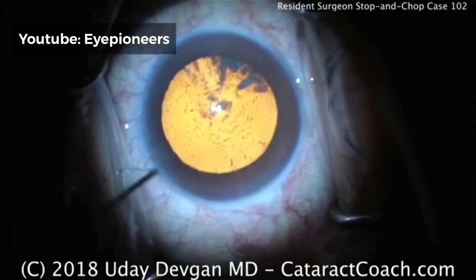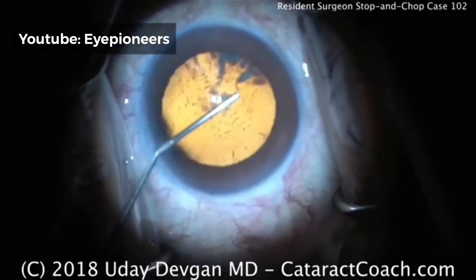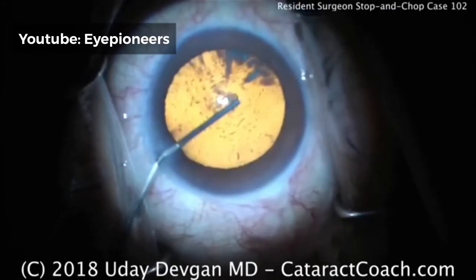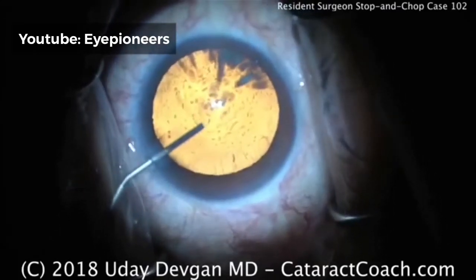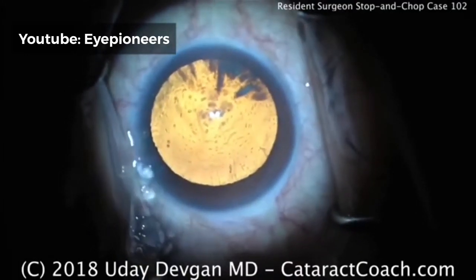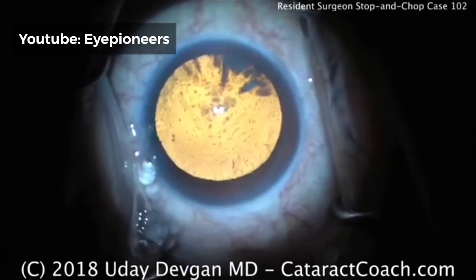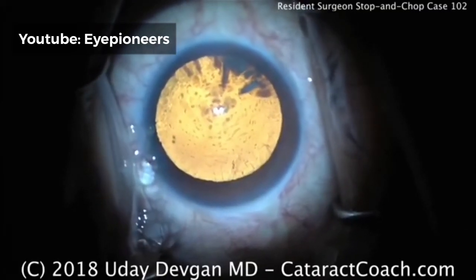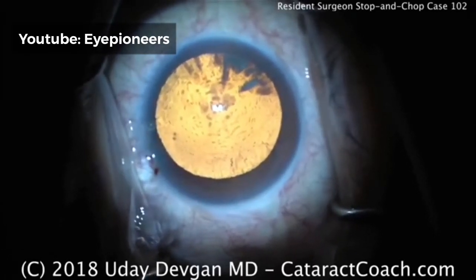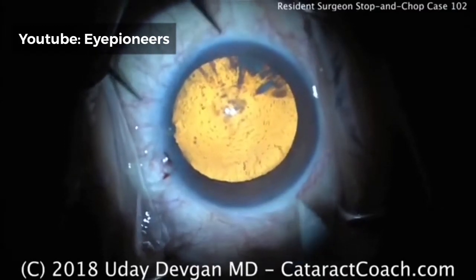The resident is now going to fill the anterior chamber with viscoelastic — injecting some viscoelastic. It looks like a cohesive viscoelastic; that's a nice strong fill. You can see the viscoelastic coming out of the eye. The plus side is it's going to make chamber maintenance better and make the capsulorhexis a little easier to do, but the downside is it's going to be washed out a lot easier.